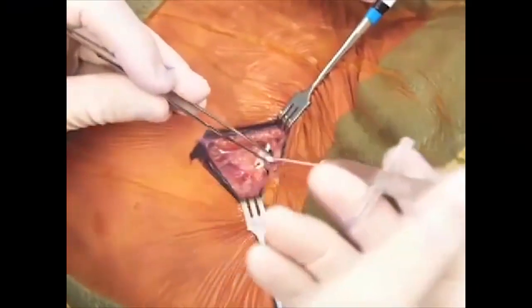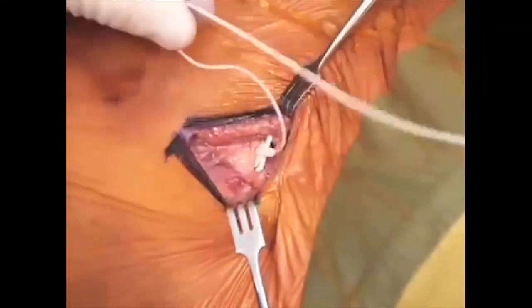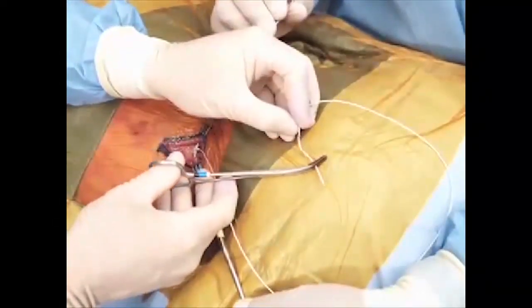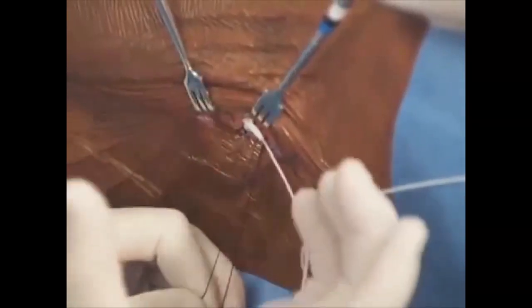Unclamp the catheter and grasp it near the anchor. Use your other hand to gently slide the dispenser off the end of the catheter. Confirm CSF backflow, and then reclamp the catheter to prevent CSF loss. Pull the purse string suture ends to close the fascia around the catheter.